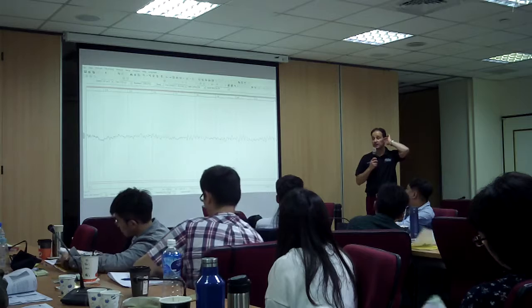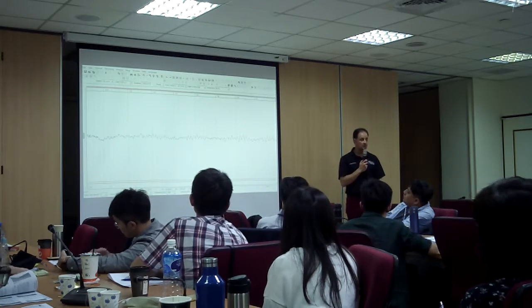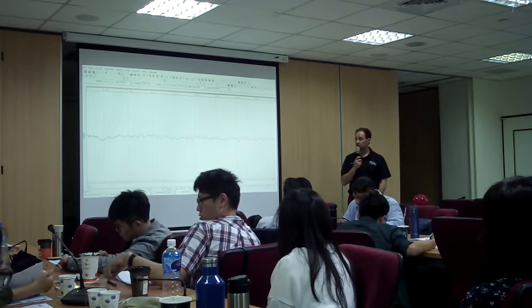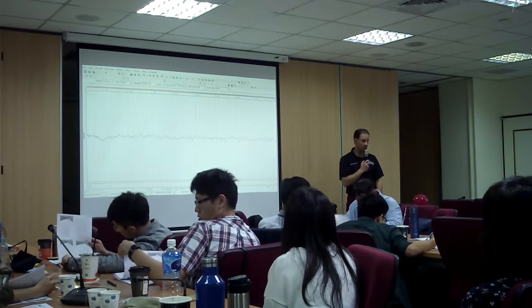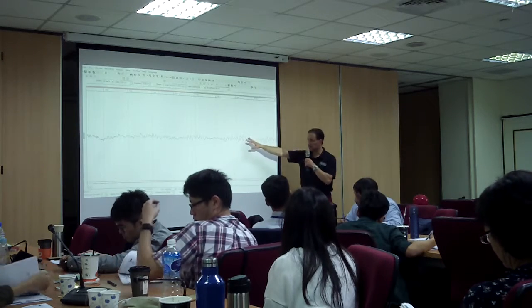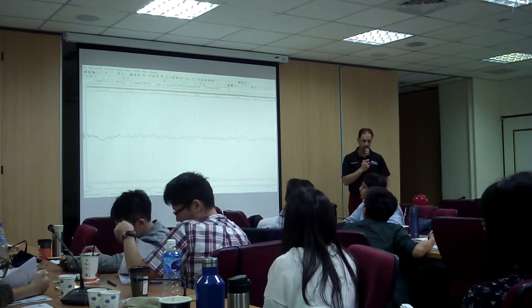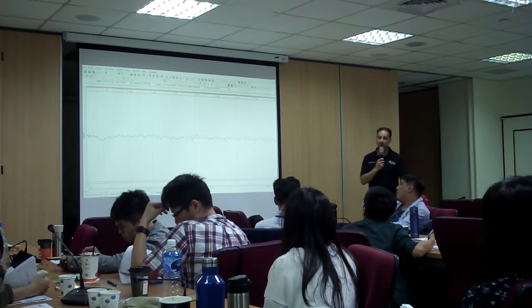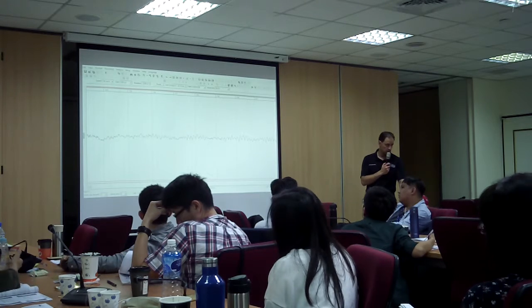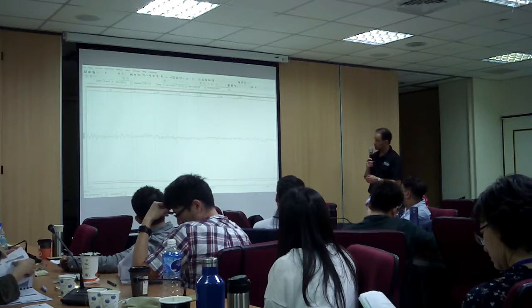So what is PZ again? What are the functions of PZ again? Self-regulation, attention, maturational lag. Okay? So, when we see slow theta, it's also common to see slow alpha, which will bring cognitive processing compromising. All right? Now, we have that.